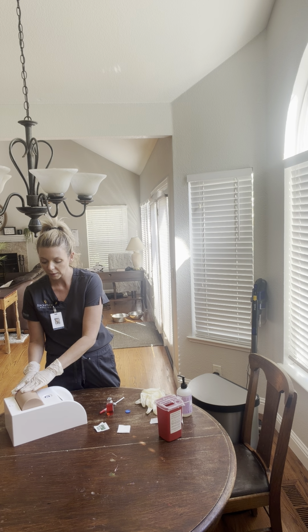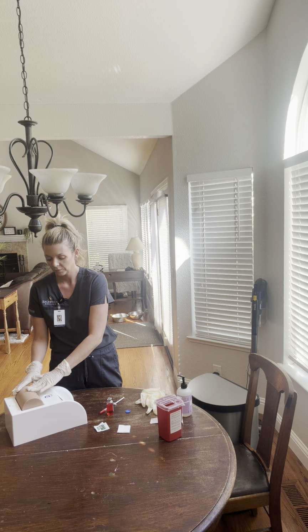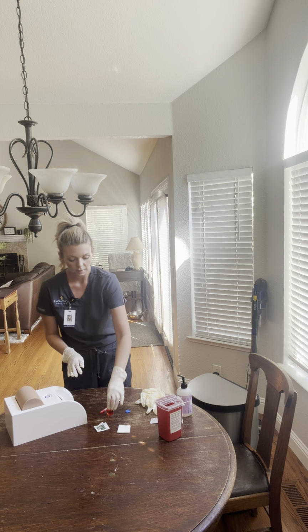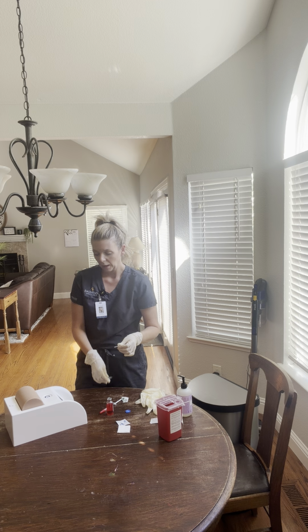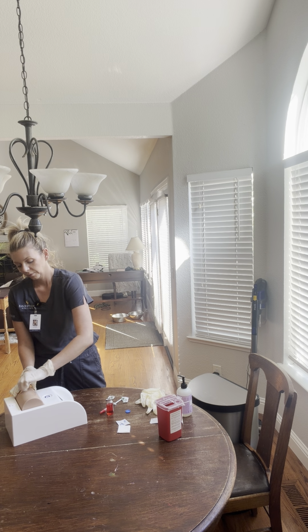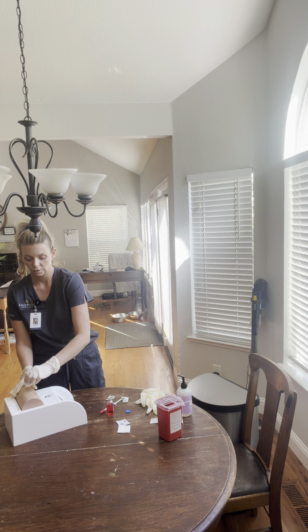I'm going to slightly palpate the skin and make sure that I don't feel anything that would be notifying me that this site would not be a good site. And everything seems great. I'm going to take my alcohol swab and I'm going to clean the site in a circular motion, going about 2 inches around.